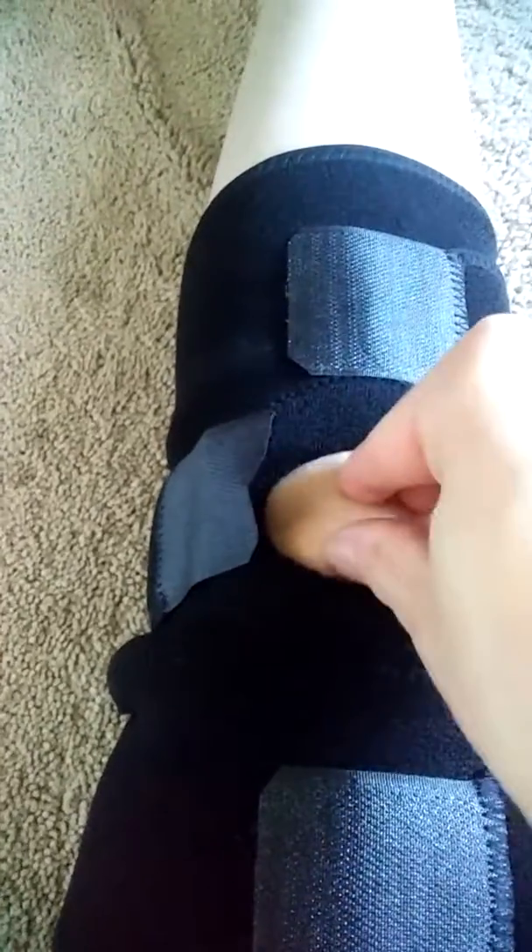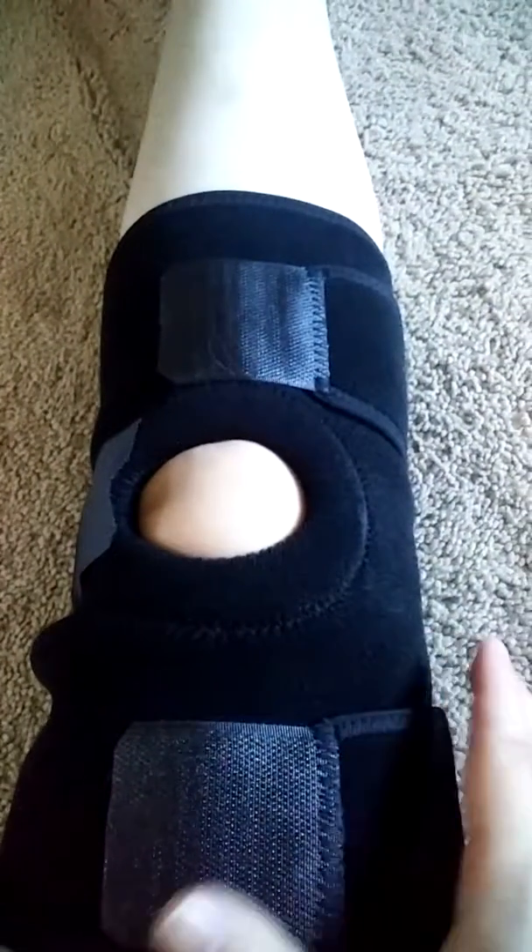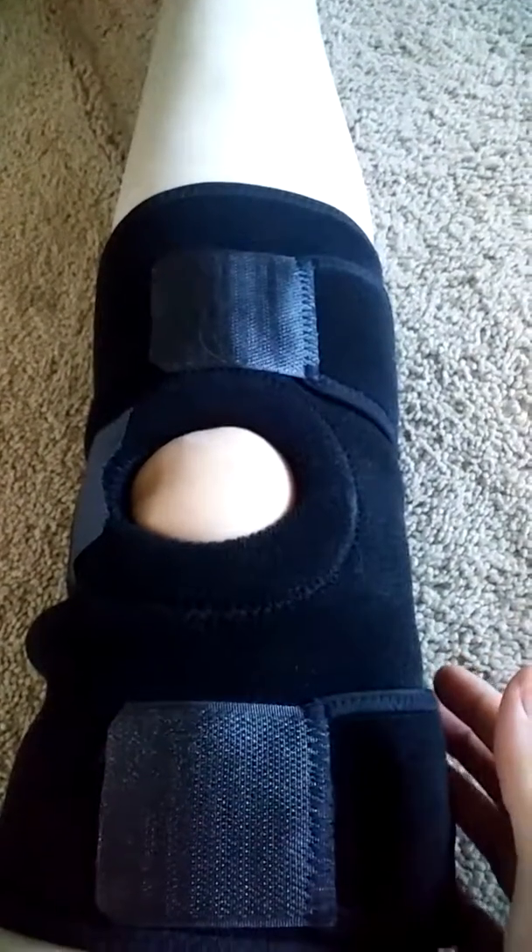It is easy to velcro on and take off, and there is a ring to support your knee. My knee fits right inside there, and I was jumping around and kind of running around. It does push right here to keep the knee from going down and out.